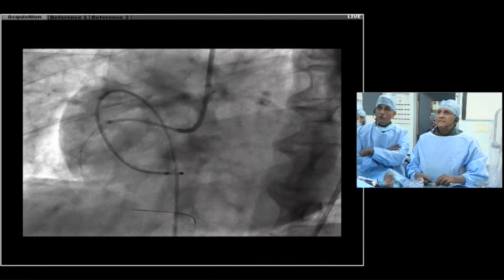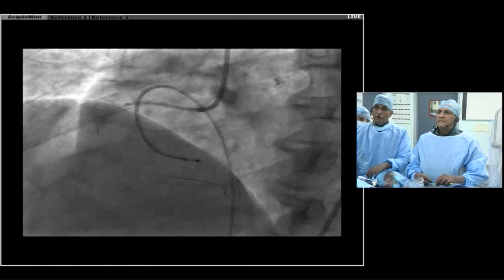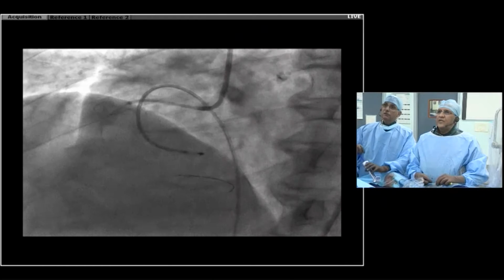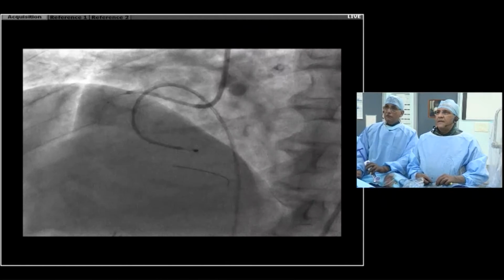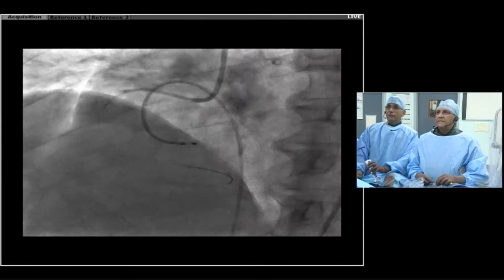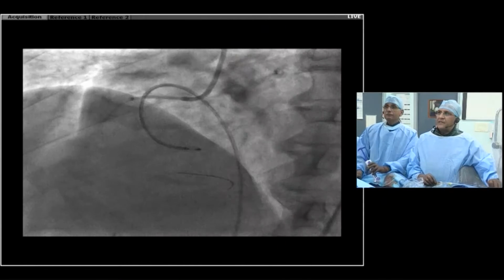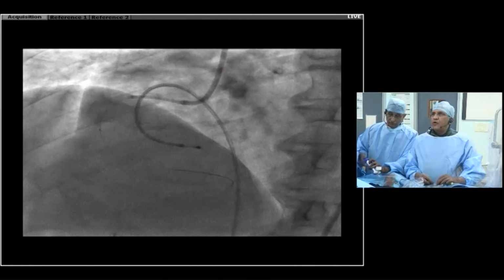If you have problems and we see your backup is not perfect, I think it's still going to go. We have more options. Just patience. A bit shorter balloon. There you go. I think we are right in the middle. Just sometimes a little patience there. Let's see this go up, and then we're going to go to the other.